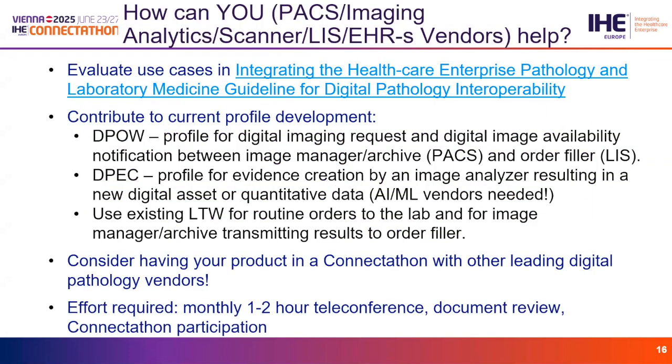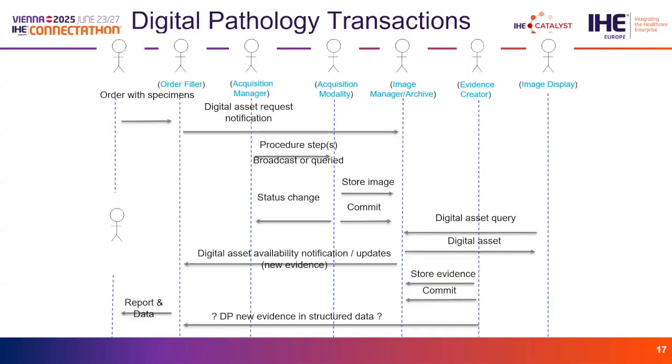And obviously, we're looking for image scanners and PACS and EHR vendors and LIS vendors to help us get more input on the ordering within the laboratory. So all the data that needs to flow between the transactions or the actors within digital pathology. And I should turn it over to Raj from here. So, thank you, Riki. Yep, happy to speak to this.